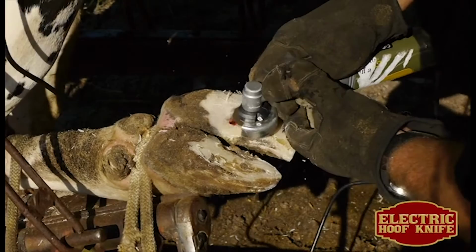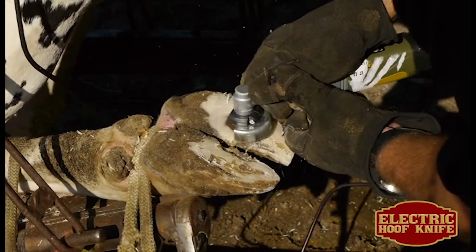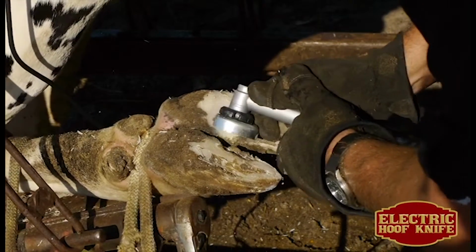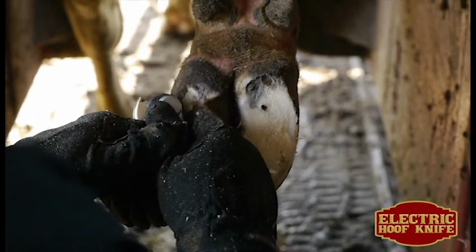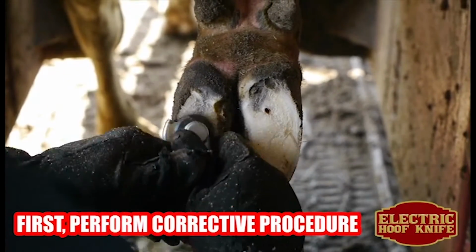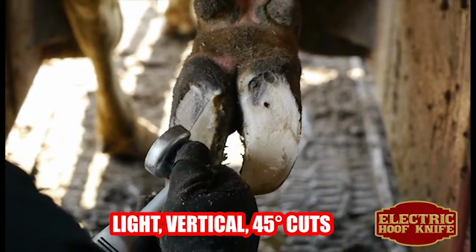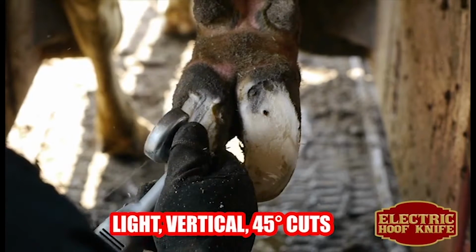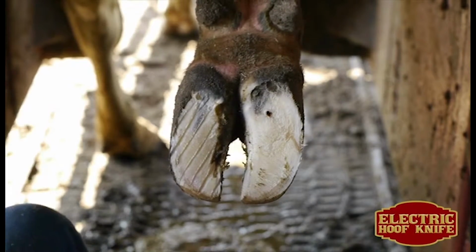There are two ways to apply blocks to the hoof of a cow to promote healing. You can apply the block to the claw that you have performed the corrective procedure on, or you can apply the block to the claw that does not have the laminitis problem. To apply a block in either of these situations, first you must perform the corrective procedure. Then, use extremely light vertical cuts and move at a 45-degree angle across the claw to create a diagonal line pattern. This will roughen up the hoof and help the glue bond to the hoof more easily.